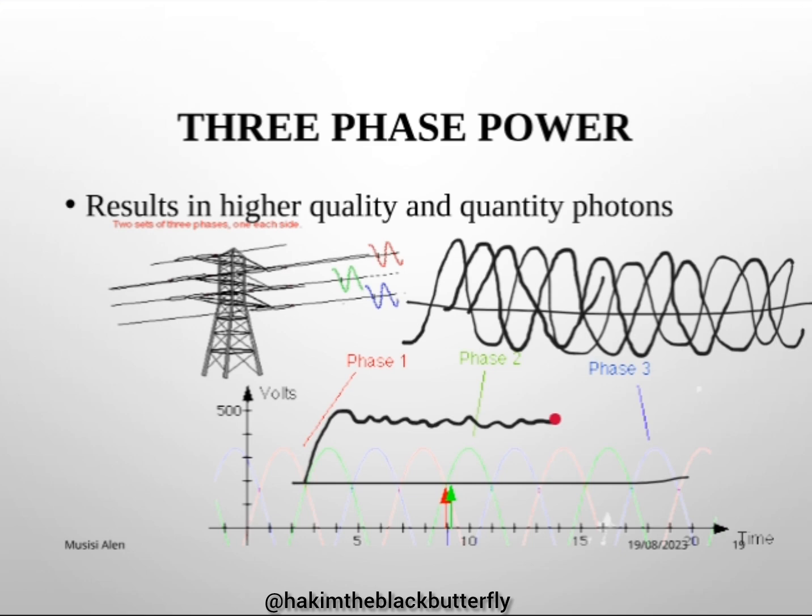But the disadvantage that this generator has is that bringing three-phase power supply to your facility is expensive. It is even more expensive than the cost of the machine you're bringing it for.